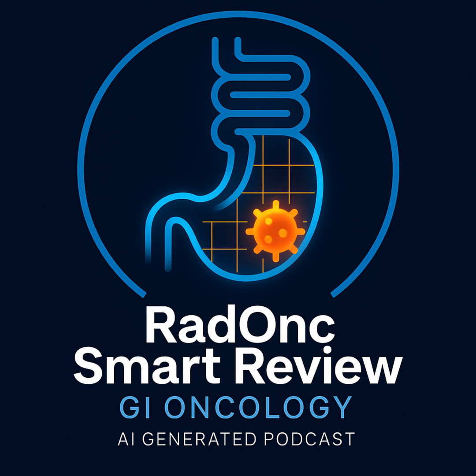Precisely. Think about organ preservation. The whole premise relies on achieving a complete clinical response with chemoradiation and ensuring that the long-term functional outcome, bowel function, bladder function, sexual function, will be acceptable, hopefully better than after radical surgery. That requires minimizing dose to those critical organs, which demands advanced planning techniques like IMRT, VMAT, SIB, and rigorous adherence to OAR constraints. So the precision allows for better functional outcomes, which makes de-escalation more palatable.